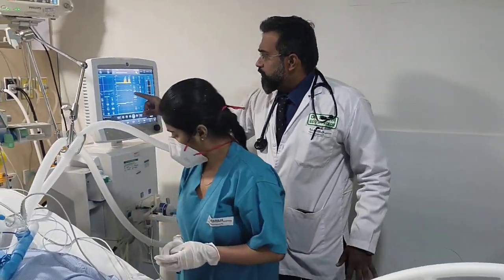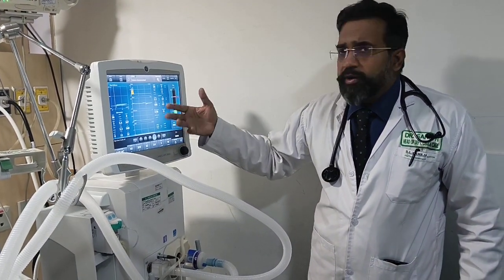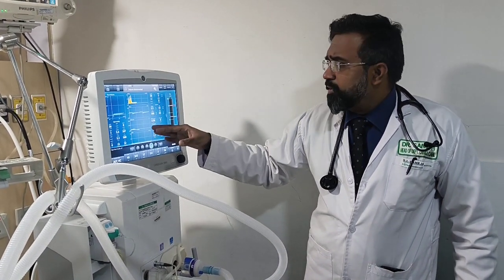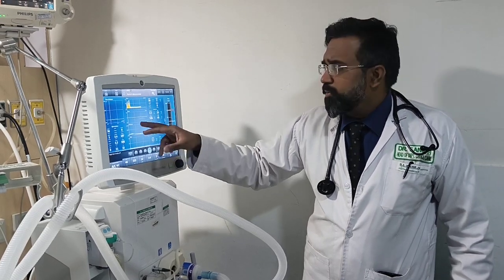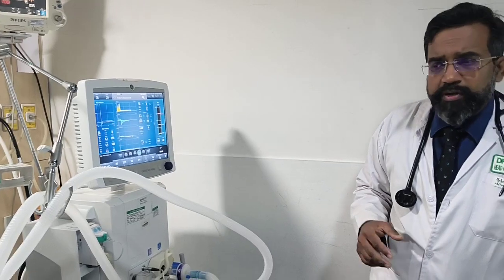Meanwhile, you also look at the peak expiratory flow rates whenever you're doing this, so that you know when to stop. At the moment, peak expiratory flow is 37. I've checked it by looking at it. As and when it improves, we stop it. So on an approximate 1 to 2 hours of nebulization, we can give levosalbutamol. Look for side effects like arrhythmia and hypokalemia. Two things that you need to look at. Okay.